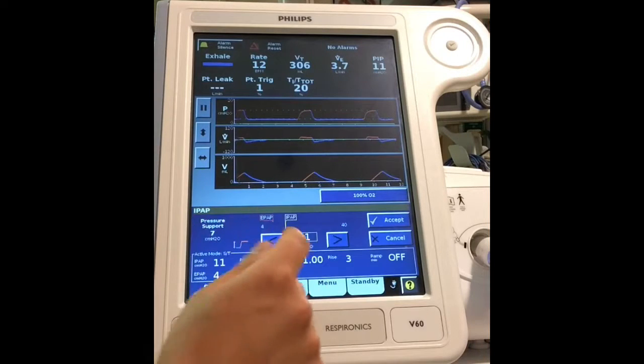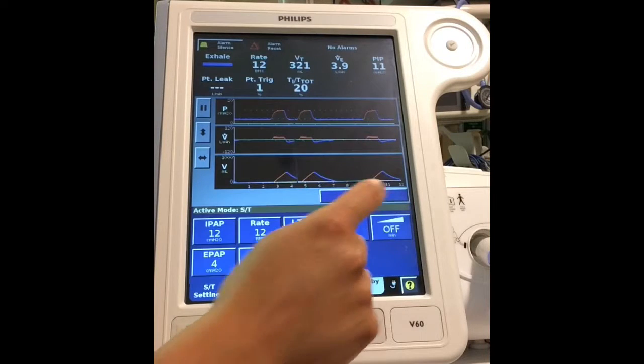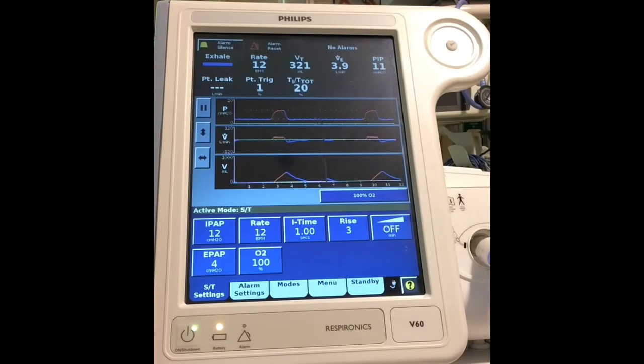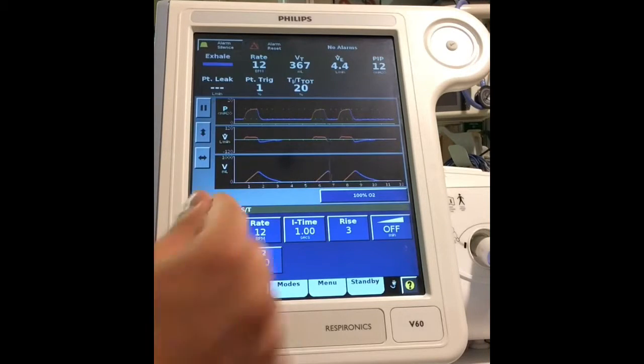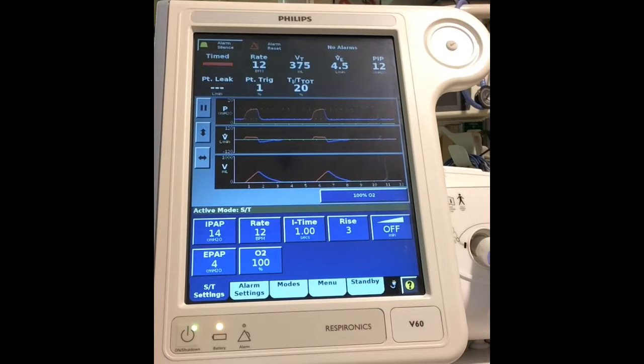So I'm going to increase it a couple more. I'll just go to 12. Just went up by 1. We're 337. It's slowly starting to climb up. Those lungs are starting to recruit already, and I'm seeing a significant change in the tidal volume. So we're still not there. Let's go up to 14. And I usually wait a couple breaths because it does take some time for those lungs to recruit.